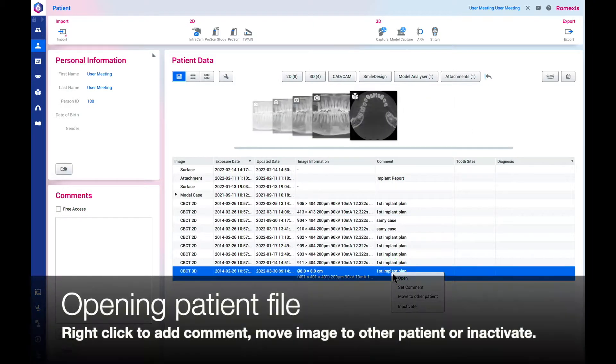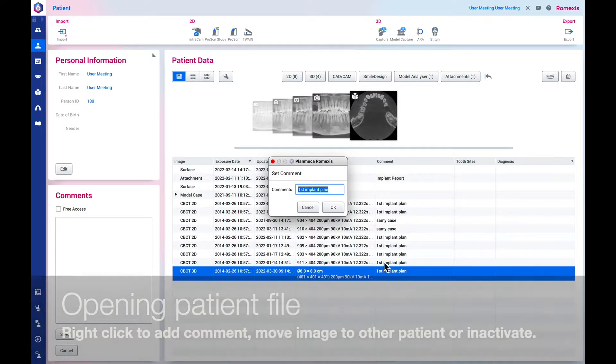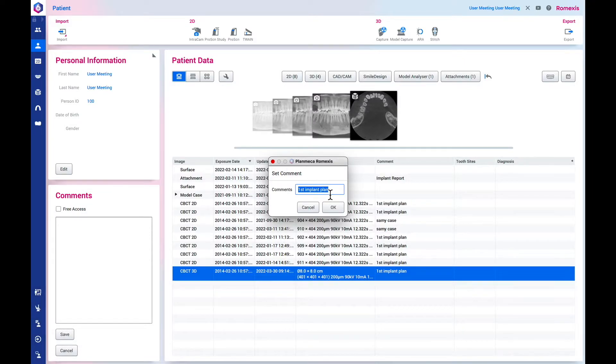Right click to add a comment, move an image to another patient, or inactivate an image.